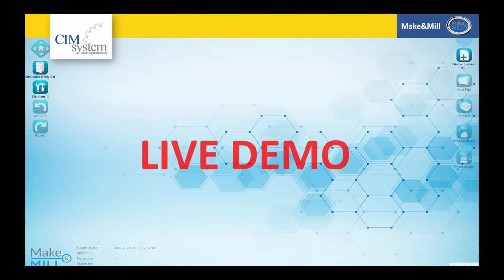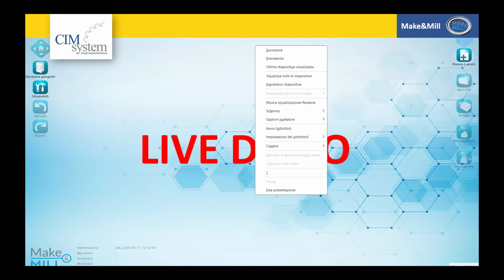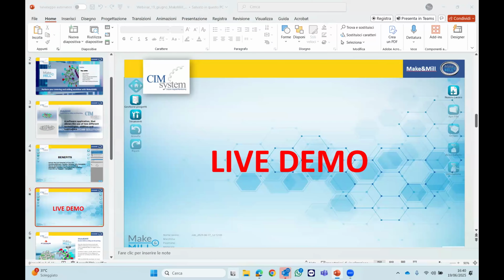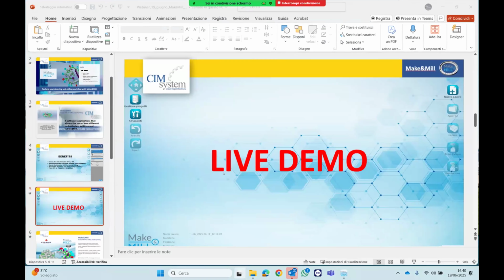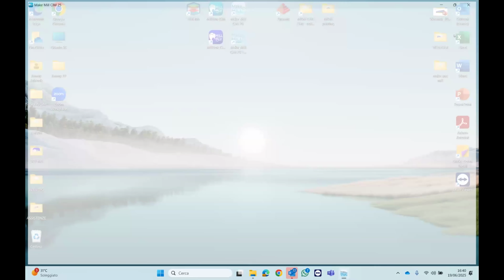So let me real quick open. I have to go out from here a second. And let me see how we can do this. Excuse me. And the presentation, I have to do this manually. Okay. So this locked down on me. Let me open it back up.